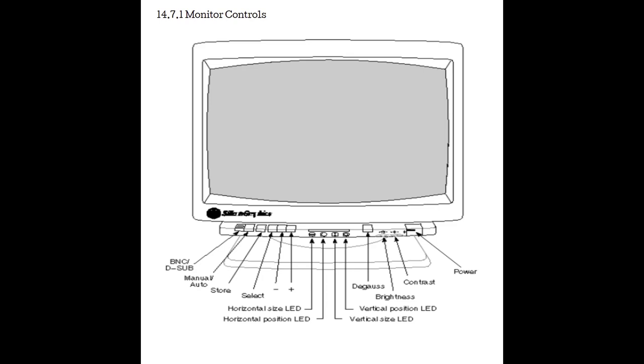If you change the brightness of your monitor to be really, really low, but then use a whole bunch of gain to counteract that in your images, everybody else is going to see overly gained images. Just because you can see a nice picture on your monitor does not necessarily mean it's going to be true for everyone. And in fact, that happens quite often. There's been many times I think my pictures look great while I'm scanning on my ultrasound system, and then I get back to the tech area, look at them on the computer, and they're super dark or super bright. And that's just the difference of monitors and how they're displaying the ultrasound data.